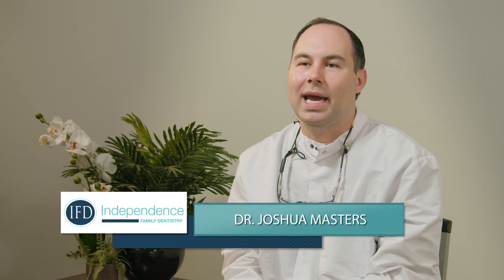A lot of people come in and they have jaw and TMJ pain, and we have an iTero machine, which we can actually scan them. We can see where the wear is on their teeth, and then we can see how much and how long the wear has progressed. And we can recommend a mouth guard, usually something they sleep in at night. And it's pretty easy to make and easy to start using.